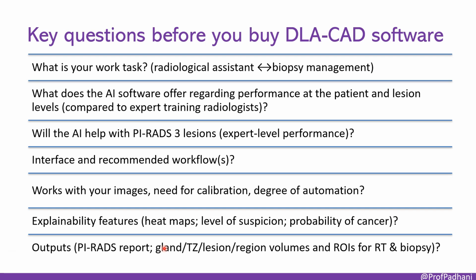Can the vendor provide solid, validated performance data, not just marketing claims? Ideally, data at both the patient and the individual lesion level. Yeah. And how does it compare against experienced radiologists? Show me the data. Show me the data. Does the software offer any specific proven utility for those tricky PI-RADS 3 lesions? That's often a key area of interest.